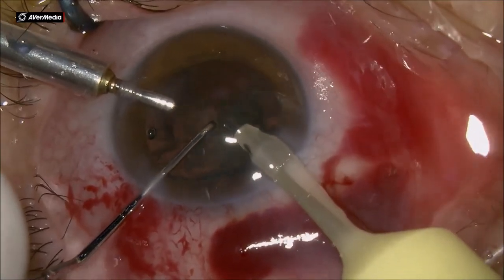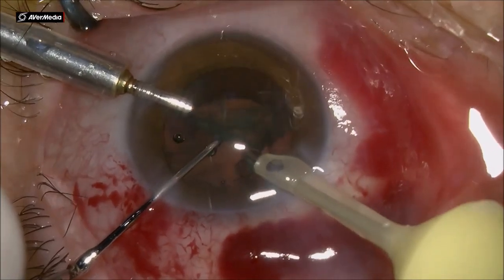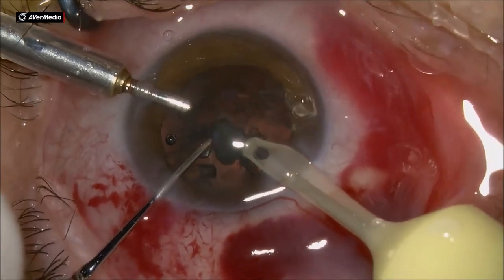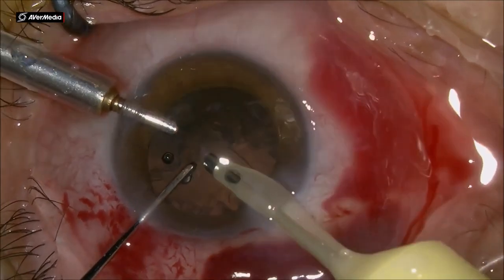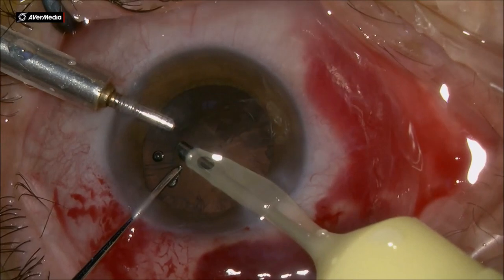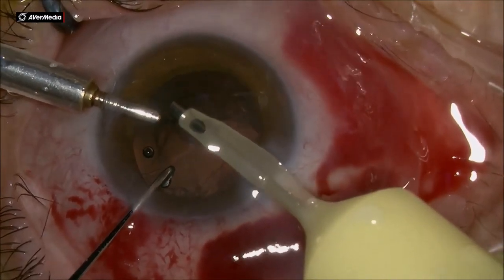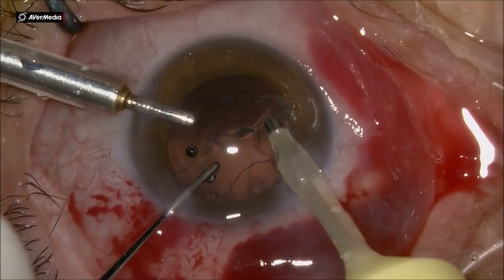Pretty easy aspirating it. And then I use this phaco tip also to clean up the bag and do the cortical removal, switching the phaco machine into the cortical aspiration and gently maneuver the cortex into the middle safe zone, and then aspirate the pieces one by one.